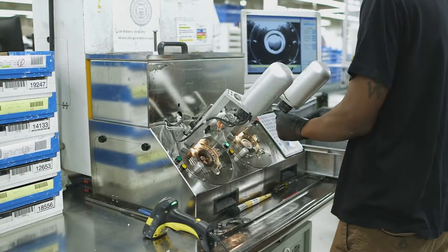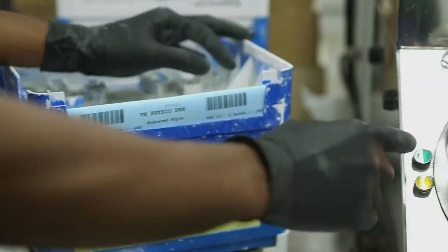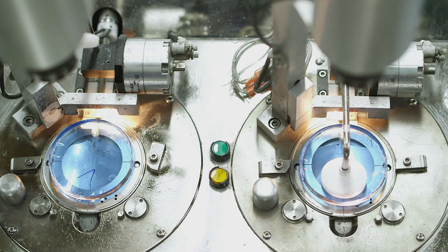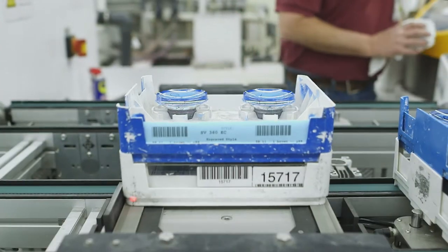Once taped, the blank moves on to the alloy blocker, which lays out the blank for surfacing and aligns the lens according to your prescription. The technician marks the optical center and the block is set on the lens.